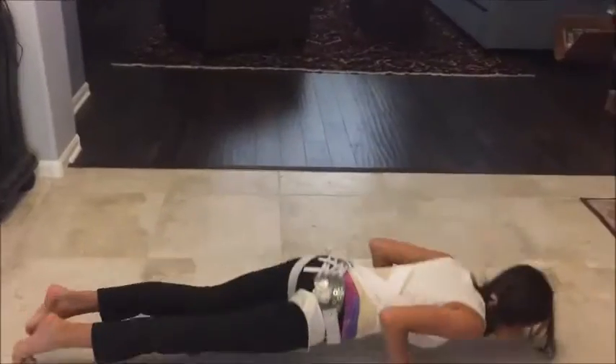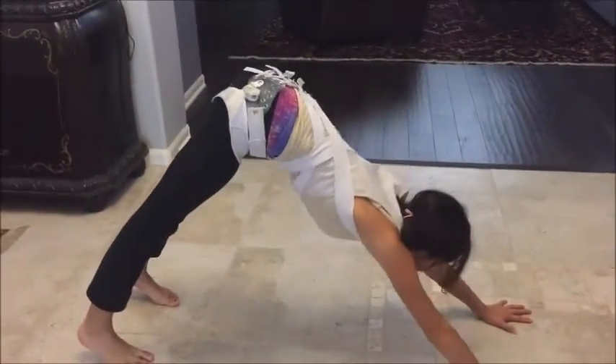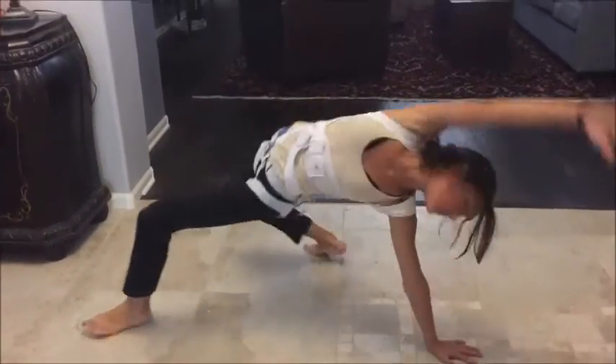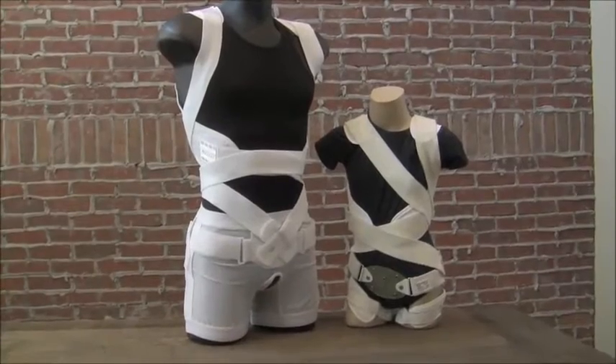So now, we take a child that's been told they need to wear a brace, and while that's not the best news they could possibly hear, they're able to continue the sports and activities that they love. They're able to wear a brace that's going to correct their problem, and no one's even going to know that they've got it on.